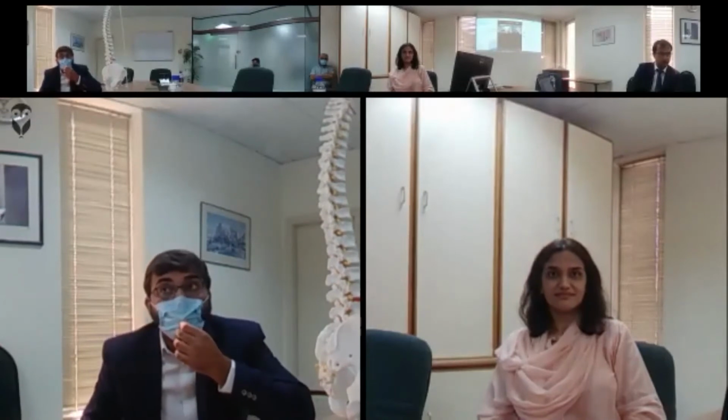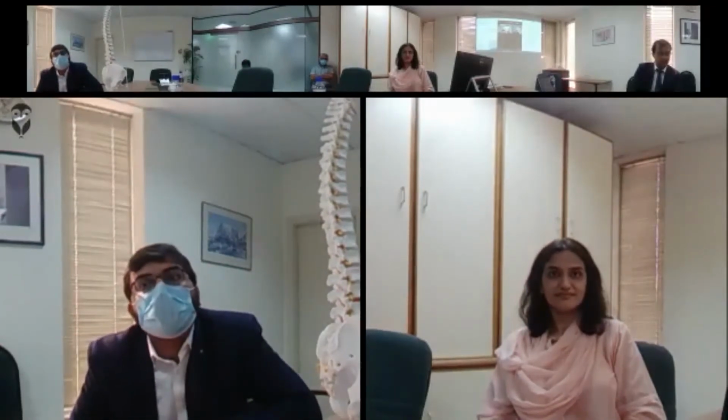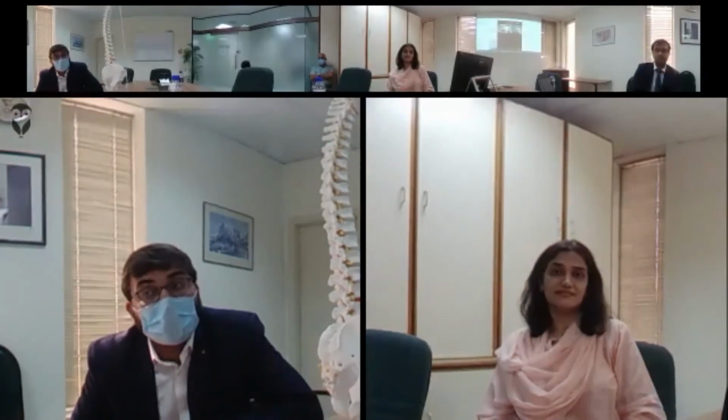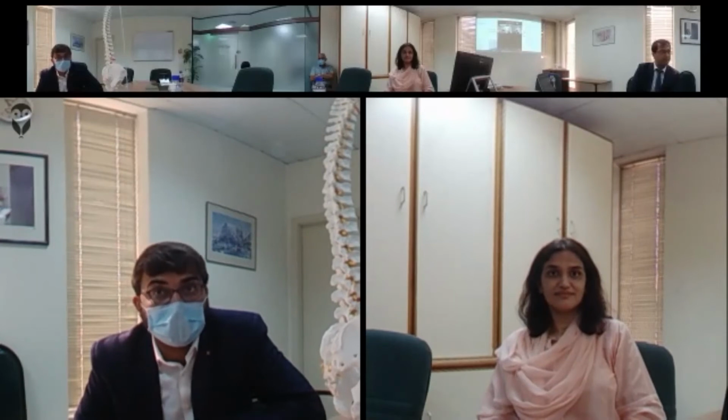At the same time, you can really dilute your contrast and use it very carefully. Instead of half a mil or 1 mil, go maybe 0.25 mils, and take more than normal time while you're placing the needle, making sure it's in the appropriate place. Don't take the chance of just injecting contrast again and seeing where it goes.